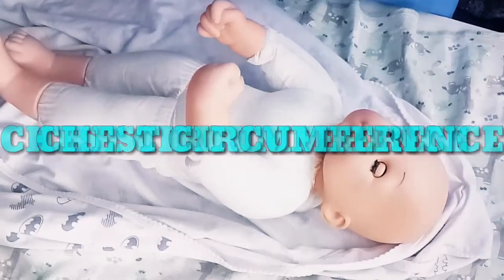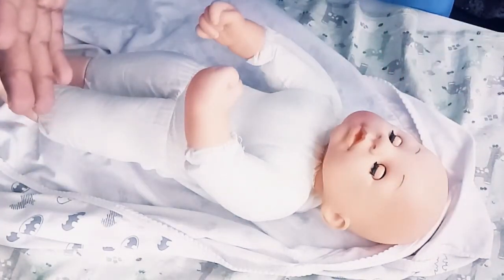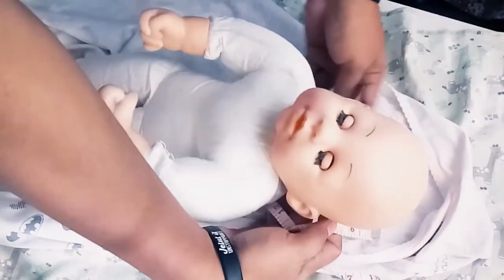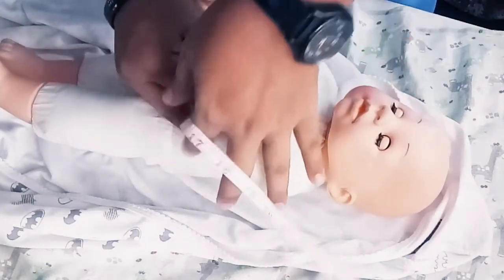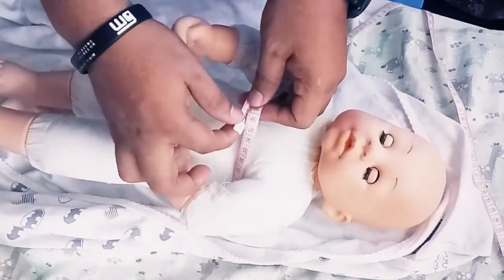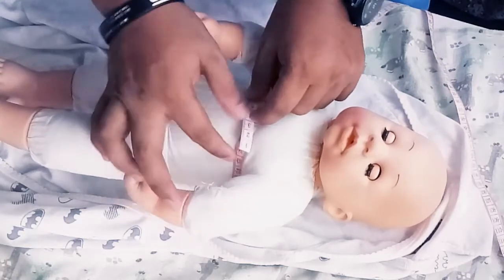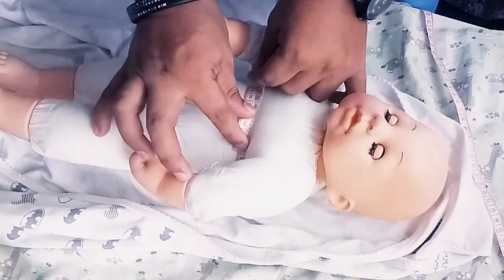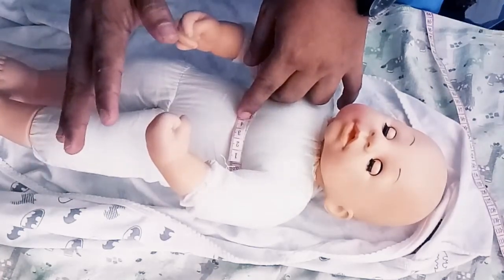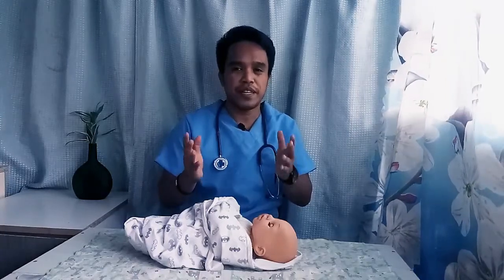Now for the chest circumference of the infant, get your measuring tape — we are measuring in centimeters. Use the nipple line as your guide. Wrap it around, gently lift the baby. His chest circumference is 32 centimeters. The normal chest circumference of a newborn is around 33 centimeters. Now we are done. Thank you so much for watching my return demo on how to get the vital signs of an infant. Bye.